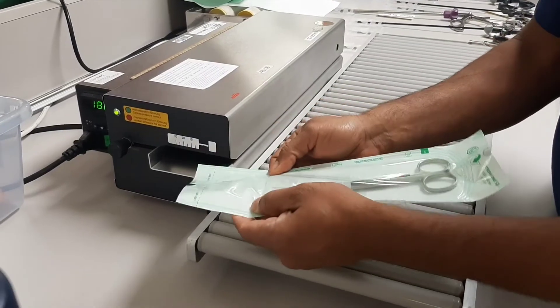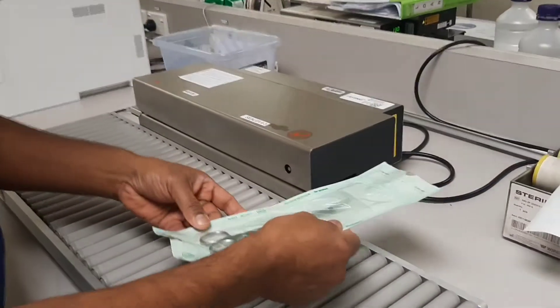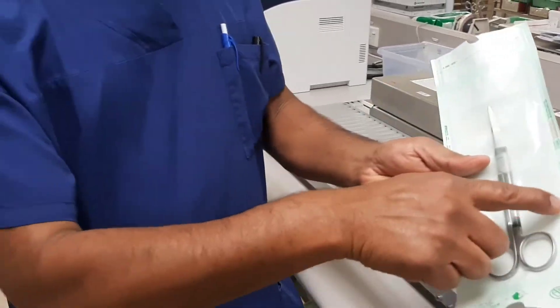The purpose of sealing is to maintain the integrity and soundness of the pack. Ensure that the seal is complete, especially in the gusset folds of pouches. Remember, once the pack is opened, it should not be resealed.